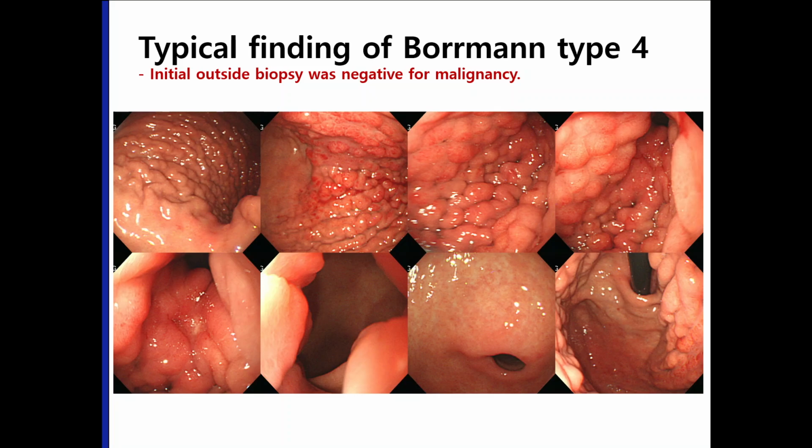Even after air infusion, the gastric body did not expand very well, and the border between lower body and antrum was narrowed. There was a small ulcerative lesion at the narrowed segment. The biopsy was signet ring cell carcinoma. Biopsies from thickened gastric folds were negative.